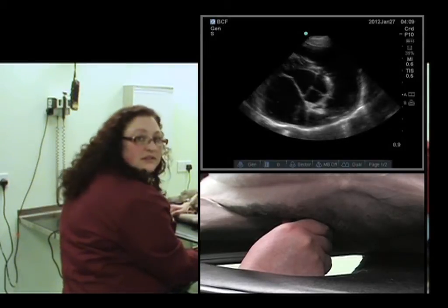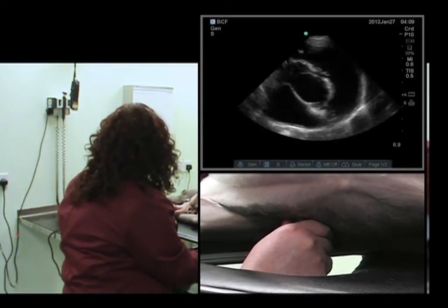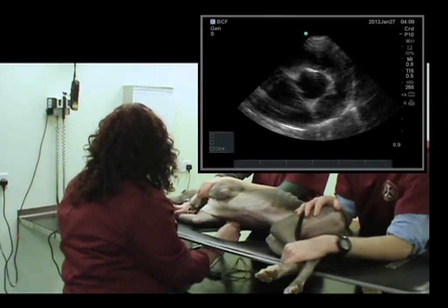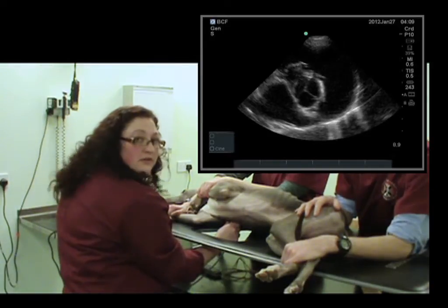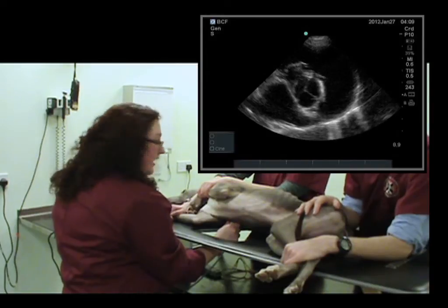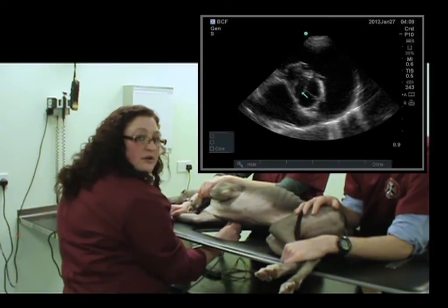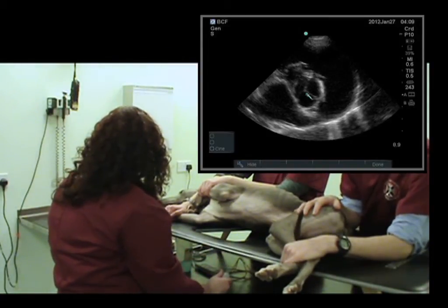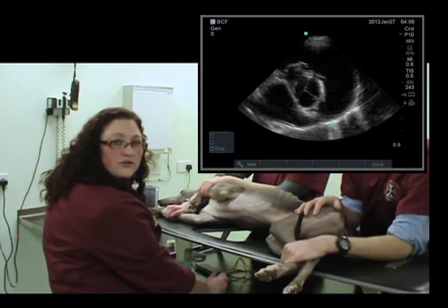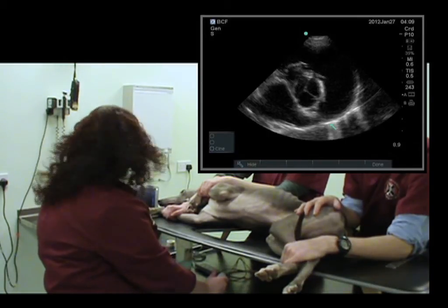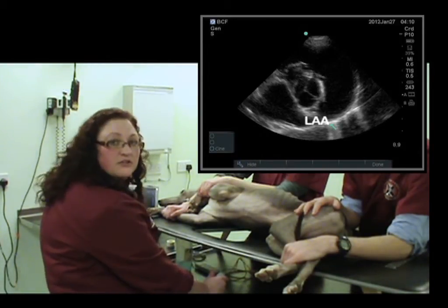We will also be able to see the left atrium coming into view. In this view, what we have is the left atrium and the aorta with the three cusps of the aortic valve. What we can evaluate is the ratio of the aorta to the left atrium to determine whether or not there is left atrial enlargement. We can also look at the shape of the left atrium and the left atrial appendage, or the auricle.